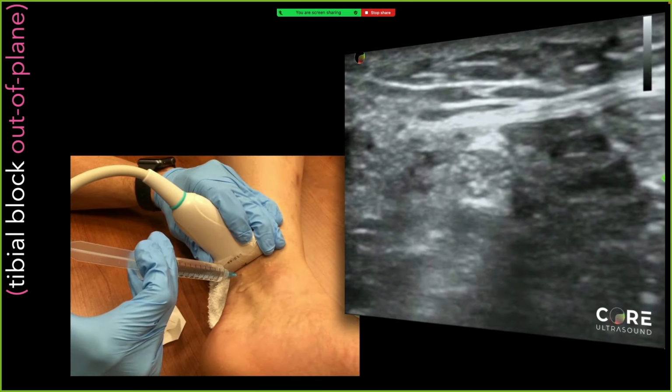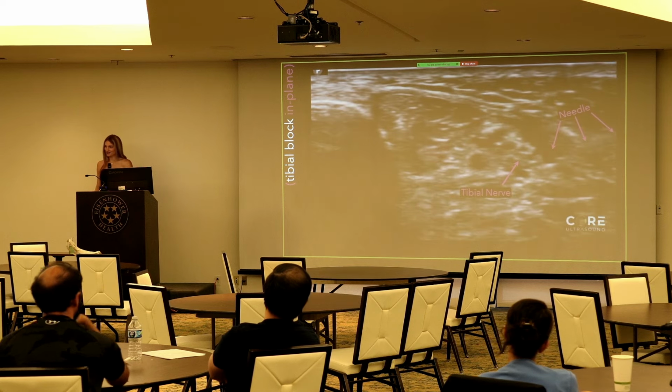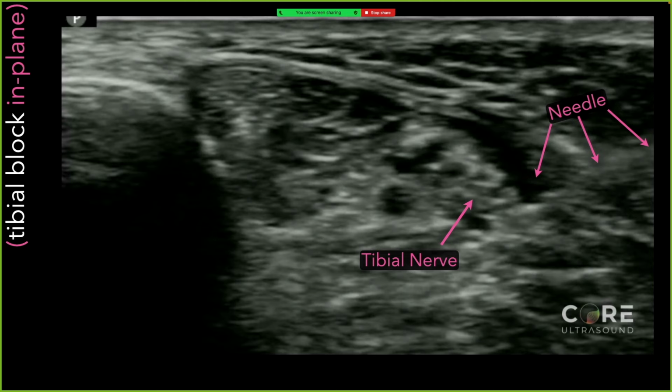And this needle, I don't know if you know that, is a 27 gauge. And the actual injection of it didn't really hurt at all. When I'm talking to patients about risks and benefits, here are the risks and benefits of sedation, here are the risks and benefits of a hematoma block, and here are the risks and benefits of a nerve block. I always tell them that because it's true, I'm a bit of a wimp and I could tolerate all of these blocks. And if I can, I feel like most people probably would be able to, because if you're using a 27 gauge cutting needle, it really doesn't hurt that bad.